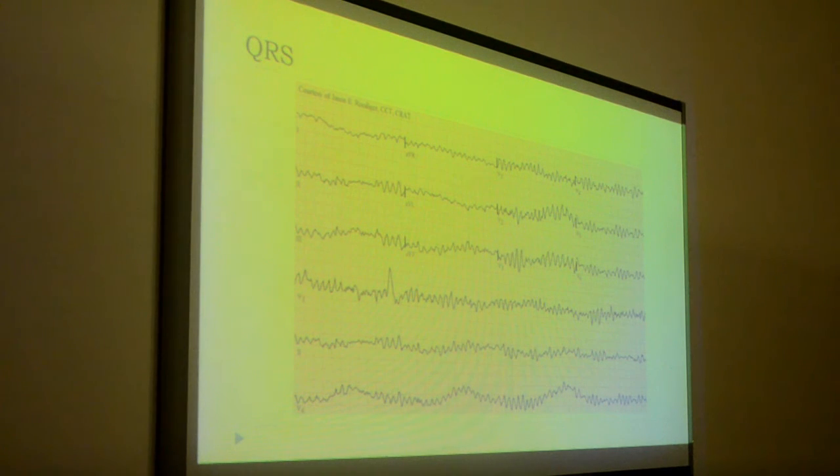Look at this. This is important. This is one of the most important ECGs you must remember. What is this? Fibrillation, exactly. This is ventricular fibrillation. This is lethal. This is probably the most dangerous finding you will have on an ECG. Now, remember what we said about atrial fibrillation: multiple reentry circuits, the atria is not contracting as a whole. The most worrisome thing there is stasis of blood and clot. Basically, the atria is not contracting, so the blood stays there.